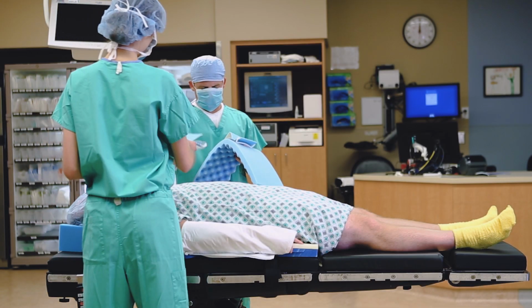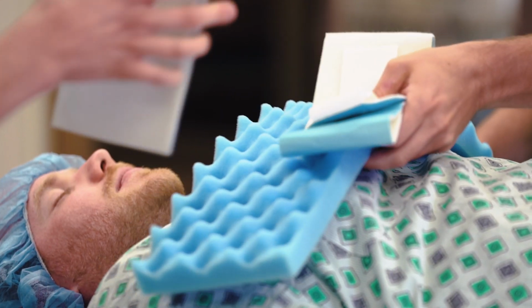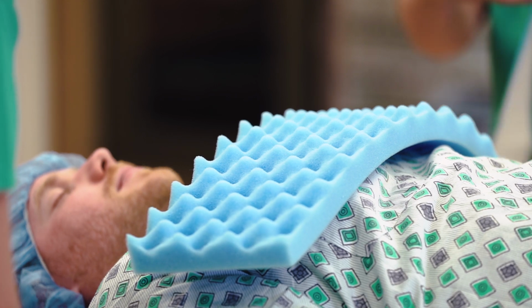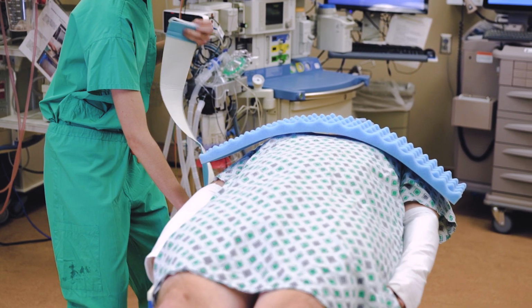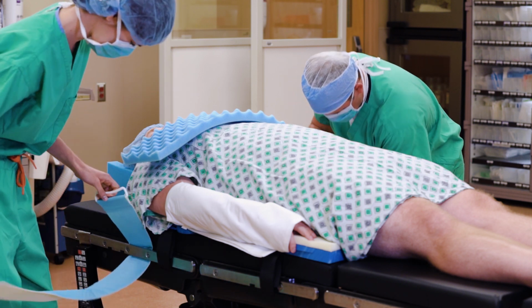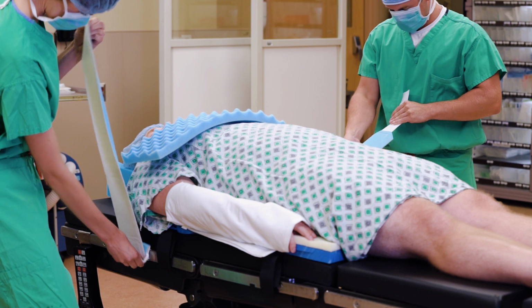To properly attach the body strap, place the blue foam over the patient's chest with the convoluted side facing away from the patient. To apply the patient positioning straps on each side of the bed, start by holding the buckle of the strap with the blue side facing you. Feed the strap through the bed rail and then pull the bottom white strap up through the buckle. Once through the buckle, tighten the strap against the bed rail.